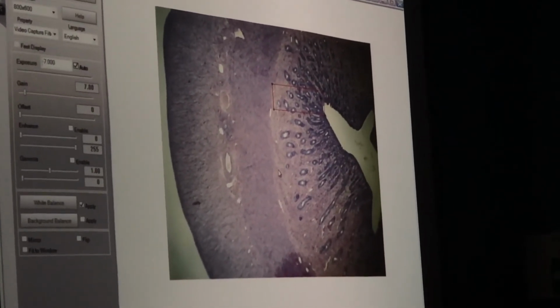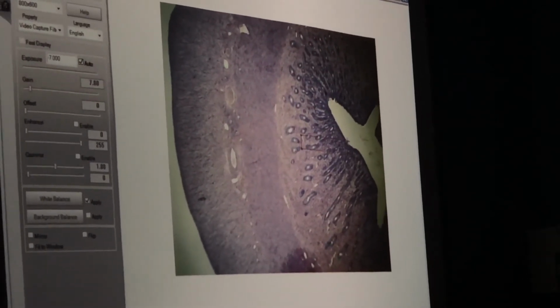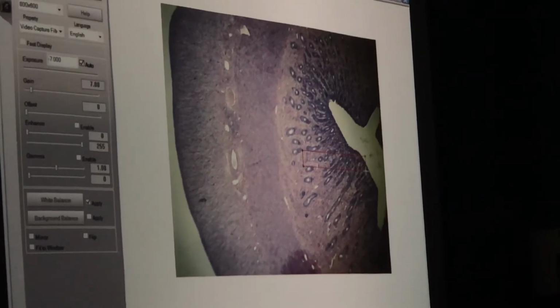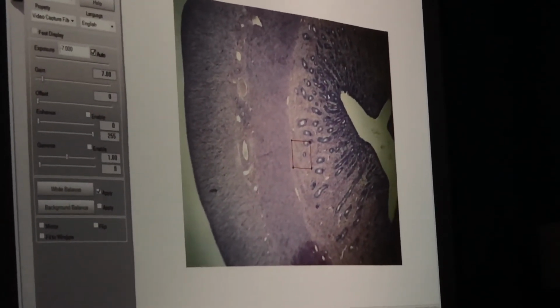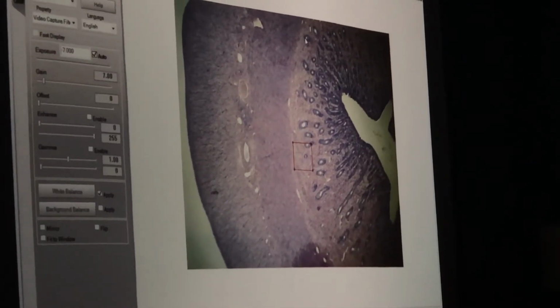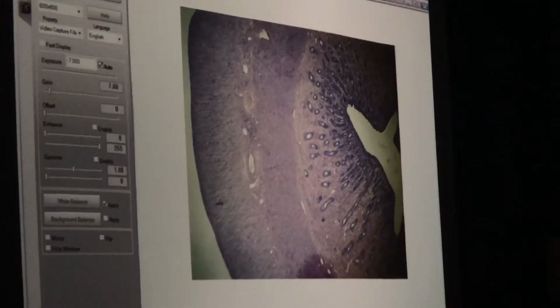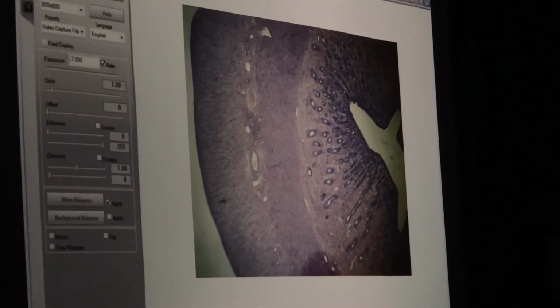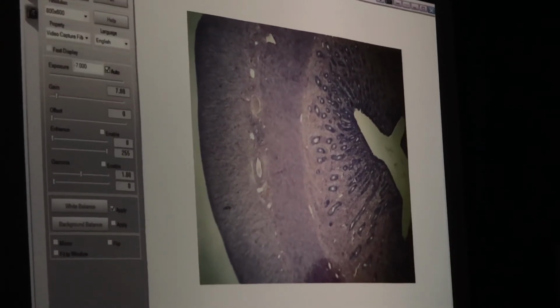So in the endometrium, how many layers do I have? 2. Okay? So I'm going to have kind of this part here, and then I'm going to have kind of this part here. What's this part? Functionalis. What's this part? Basalis. So where does one end and the next begin? I don't know, kind of in this area here. If I put the pointer here, you're going to say basalis. If I put it here, you're going to say functionalis. What are these whole things?